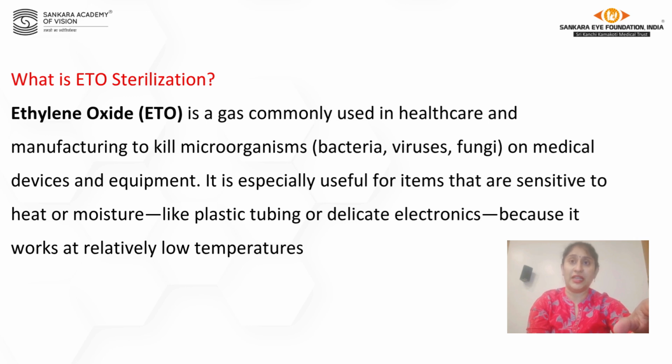So we know ETO is a gas commonly used in healthcare and manufacturing to kill microorganisms on medical devices and equipment, especially heat-sensitive and moisture-sensitive items like plastic tubings and delicate electronics, because it works at relatively low temperature.